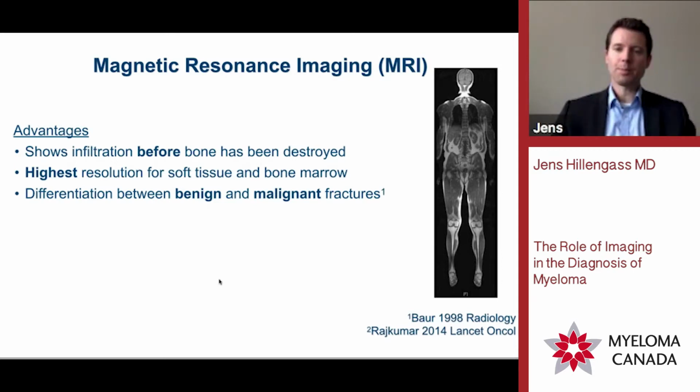And with the MRI especially, we can differentiate where the destruction of the bone took place, if there were a lot of cells, which would rather be a sign that there are a lot of plasma cells, and so myeloma, or if there are very few cells, which is usually in us, in elderly persons, and I even have to say in my age, the content of the bone marrow becomes more and more fatty.